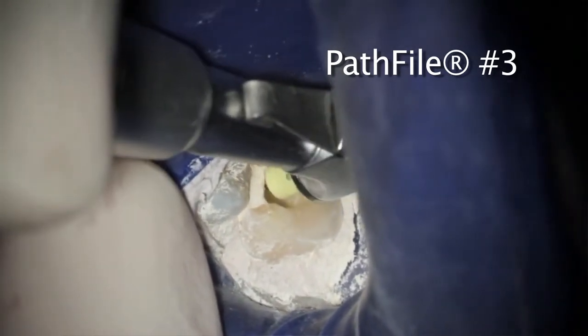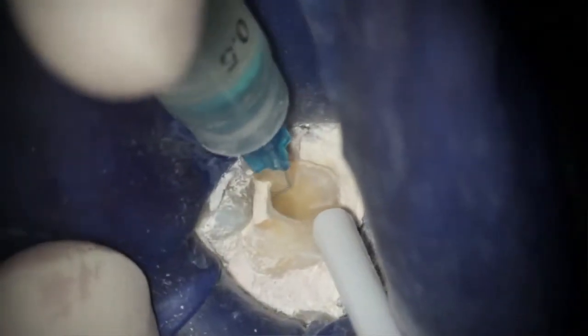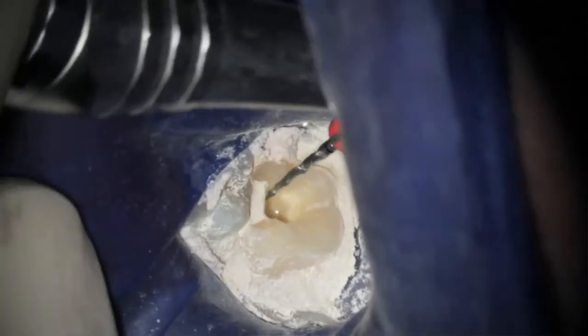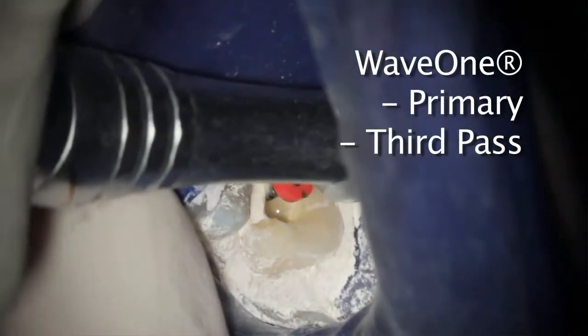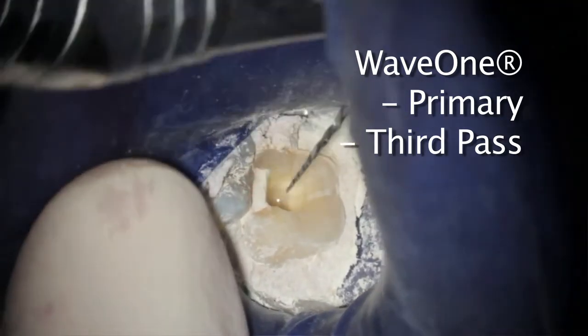Here I am taking a number 3 path file back in the canal to loosen debris created by the WaveOne reciprocating file. The irrigating needle now penetrates more apically in the canal space. The WaveOne is inserted in a third time, and this time it is able to achieve proper working length. This time the irrigation needle penetrates to within 1 millimeter of the predetermined working length.